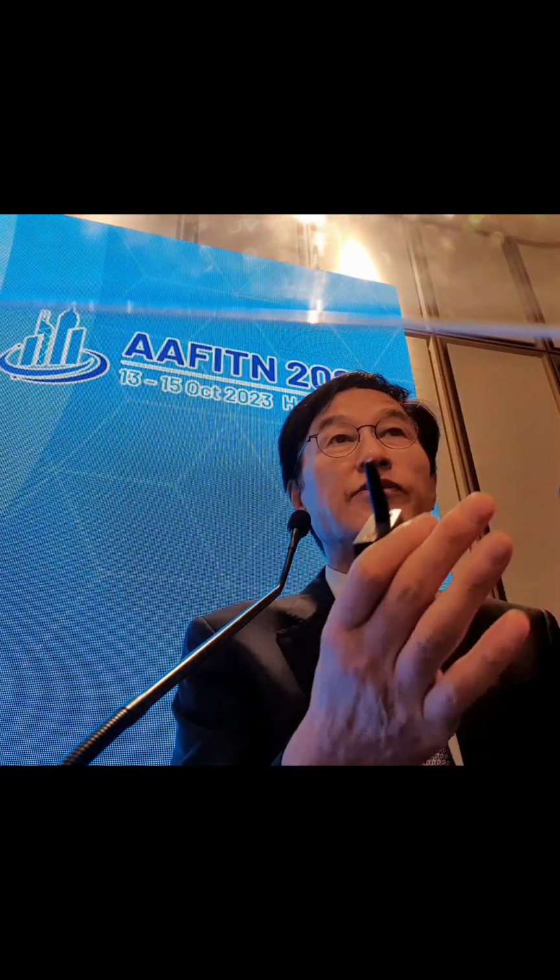Of these two aneurysms, the lower one is the anterior choroidal artery aneurysm, and medially there is the anterior choroidal artery. We thought we packed well, but at 3 months there is some small filling in the aneurysm, and 15 months later there is a bigger recurrence. When we got the 3D angio, there was a large recurred space within the coil mass.